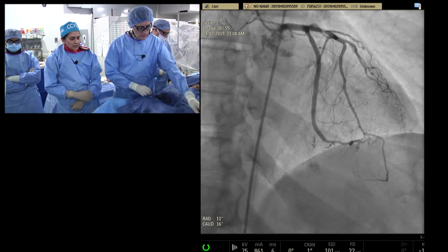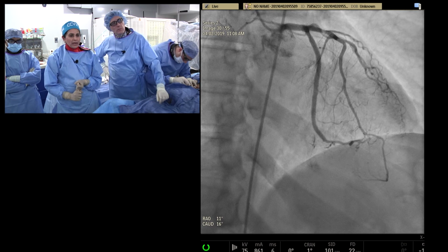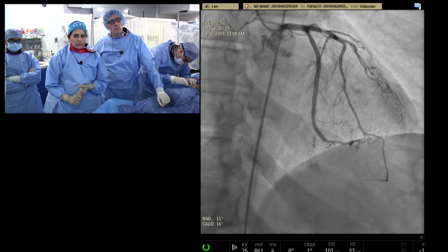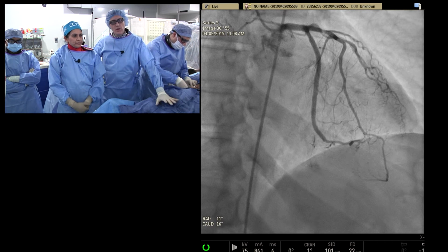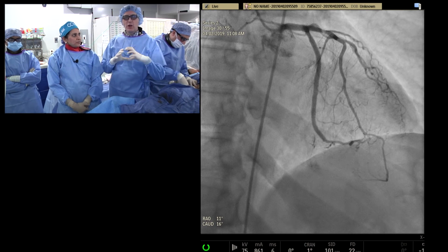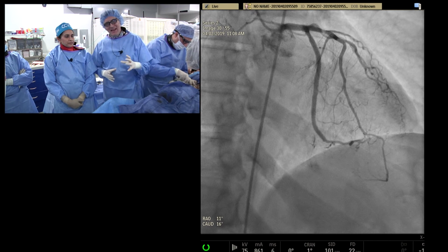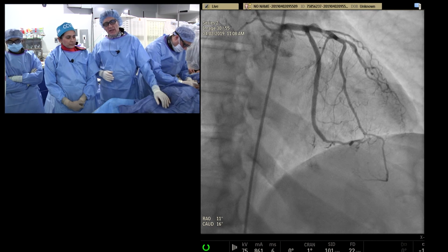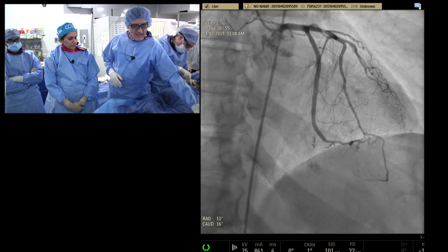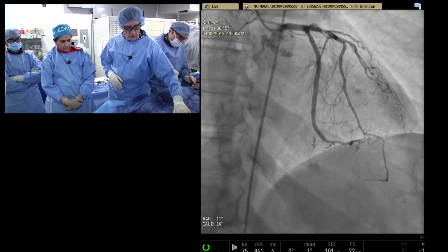So, if the platelets are well inhibited and our IVUS shows the stent is well expanded, the risk of stent thrombosis is less than 0.1% for her. Very low risk, because you have the circular stent with a very good MLA above 7 and with the PRU under 133 on steady state Plavix, not an effect of some kind of loading.